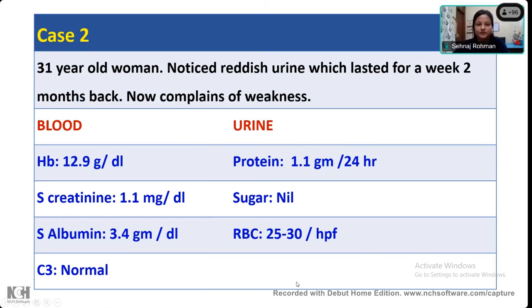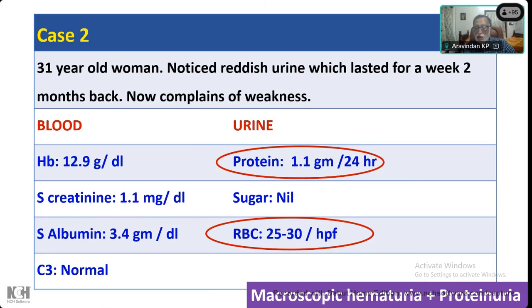Yes, sir. Mild proteinuria, and there is hematuria as well. Even grossly, in the history, they say passing reddish urine. So episodically, they must be having macroscopic hematuria also. So this is what you would call macroscopic hematuria plus some kind of proteinuria. So when you have this kind of picture, what are the things that you will think of? What would the clinician be thinking, in fact?